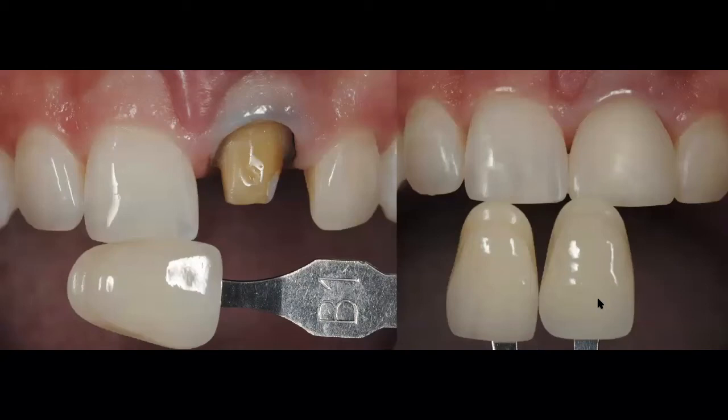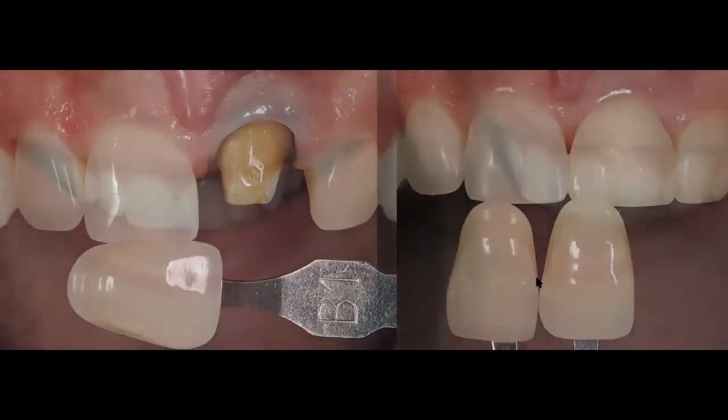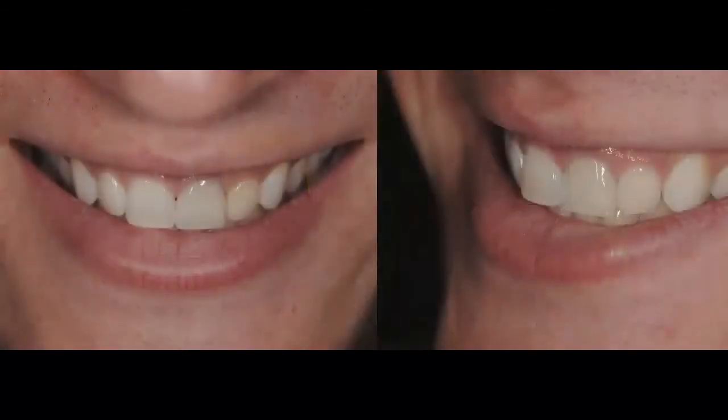And here, now we are taking B1 and A1, and we're putting them right next to the tooth. Because we knew that we had a little bit of a darker shade over here, and a lighter shade over here, we were just telling the lab, this is where we're at. These are the shades that we're looking at, because this is what we have in the patient's mouth, at least close to these shades, very close to them. What can we do to get this to match?